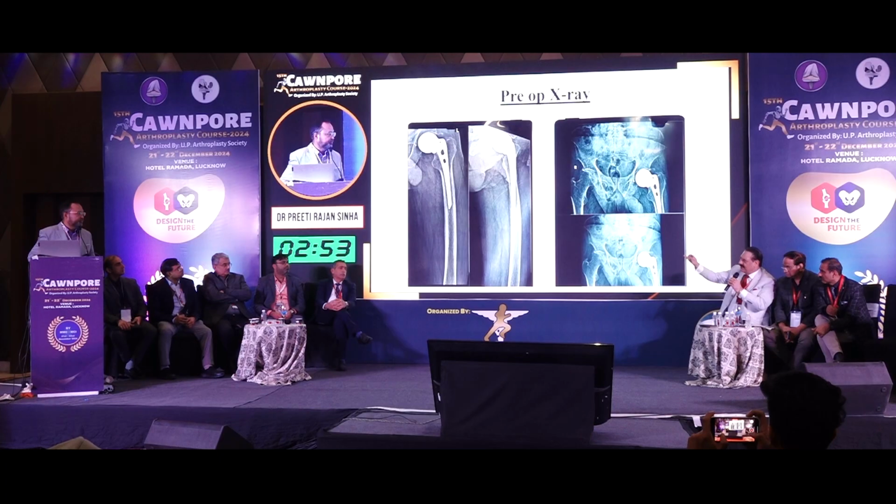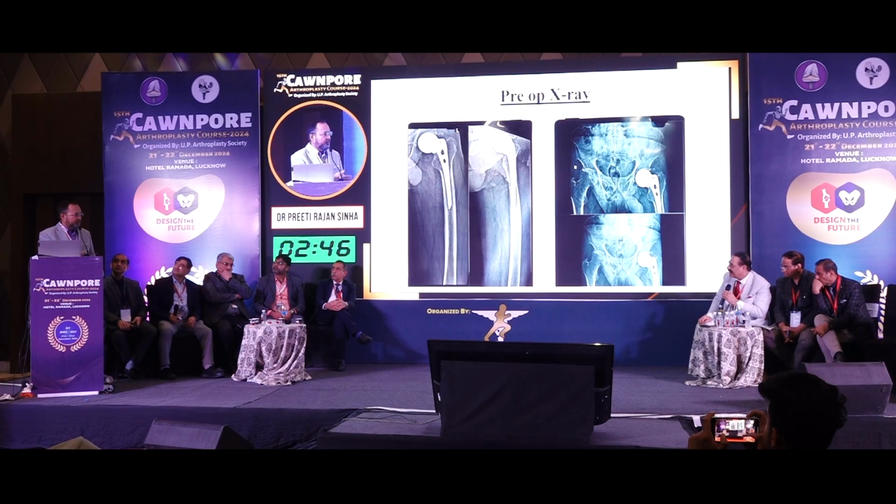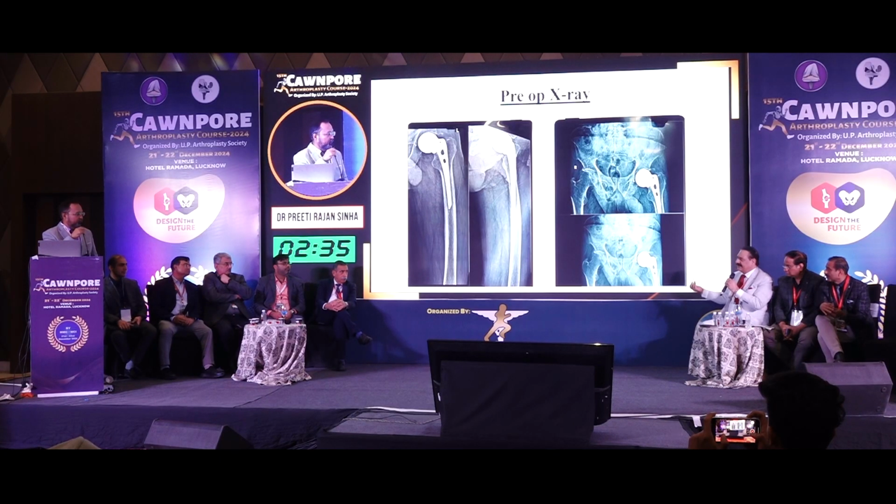Cup, cemented or uncemented, your choice. Both work very well. Sir, since ESR and CRP were normal, I didn't aspirate the hip. And what about the choice of implant, sir, in this case? As you told, but the patient was of low budget. Cemented, both sides cemented, no problem.